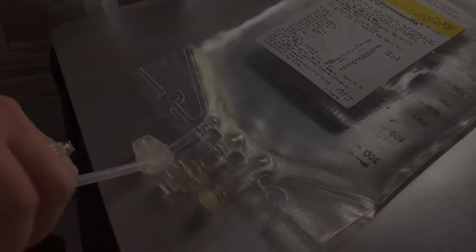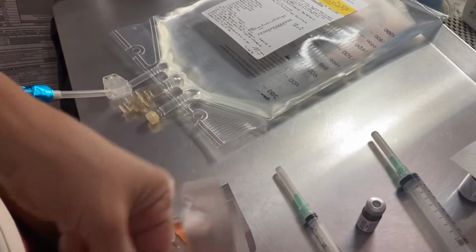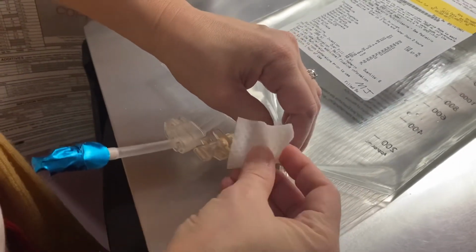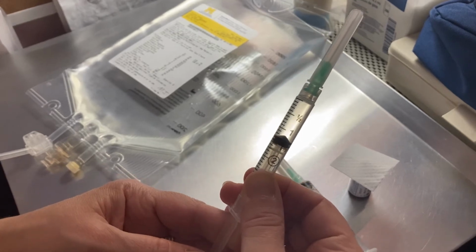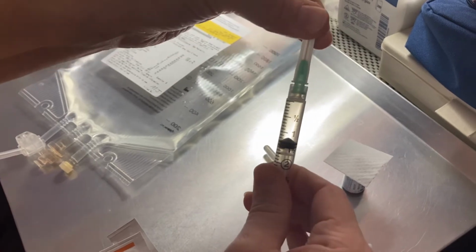Remove the red foil. For 15 seconds, scrub the top of the first vial closest to you. While it dries, scrub the surface of the port you just removed the red foil from. Pick up the corresponding syringe. Since you cleaned the small vial, you'll use the small syringe. Pull back the plunger to 1 milliliter, twist the needle to the left to tighten, and remove the cap.